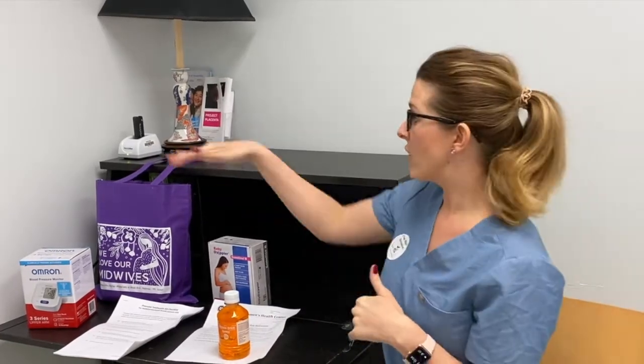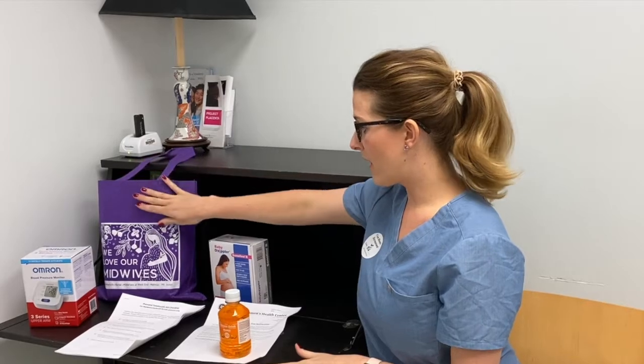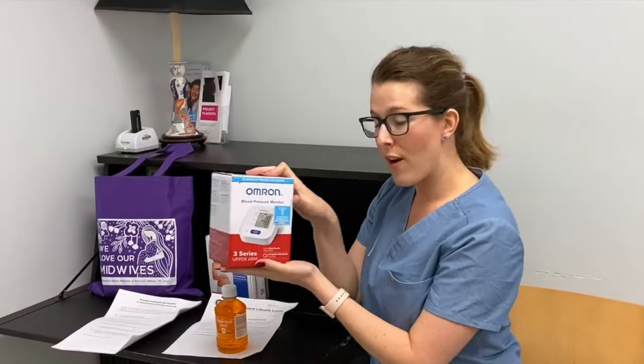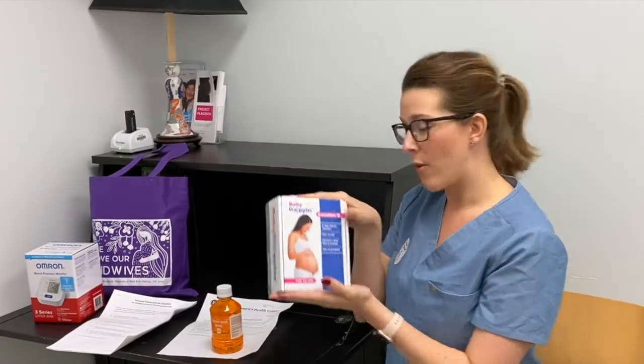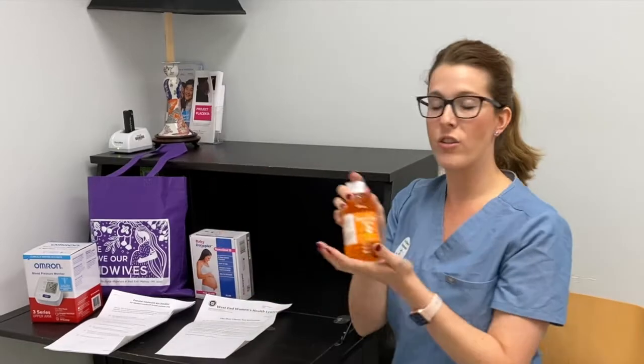So I'm going to start by just showing you what's in the kit. It'll come in your purple bag, and in the kit there'll be three things. One is the blood pressure cuff, which we'll go over how to use. Another is the doppler, which we'll also go over how to use. And then the third is your glucola.